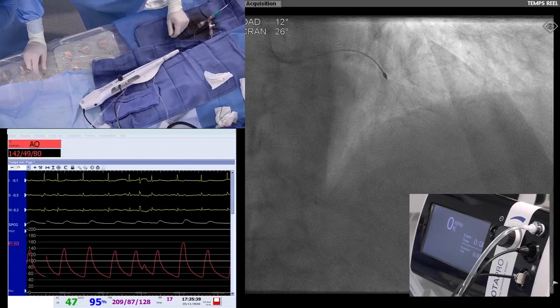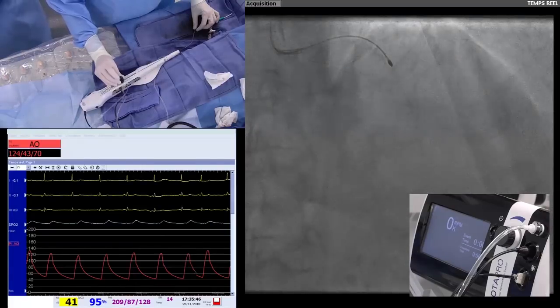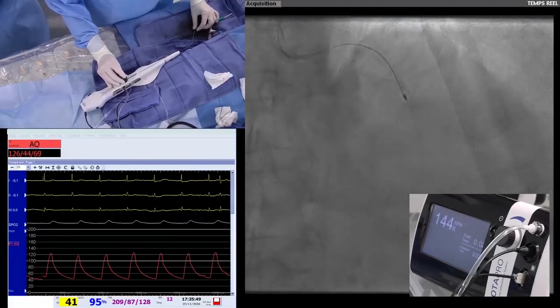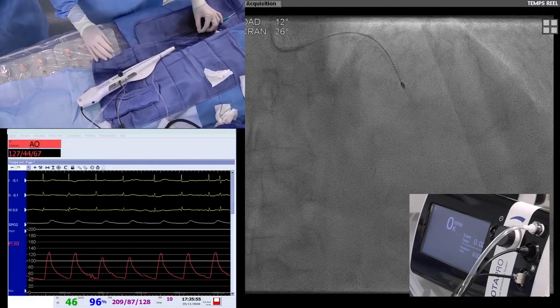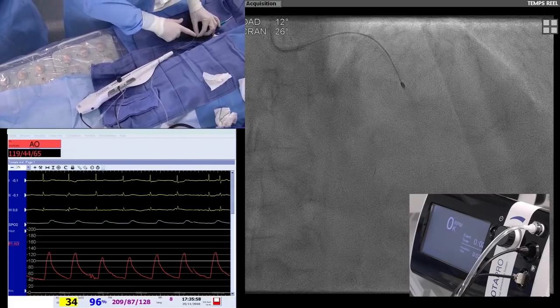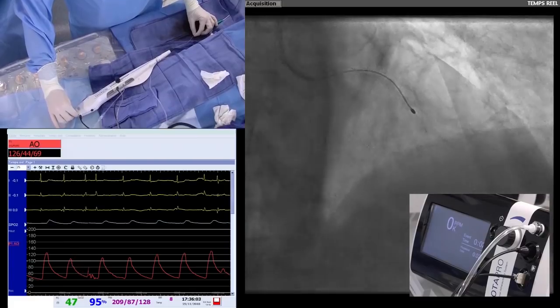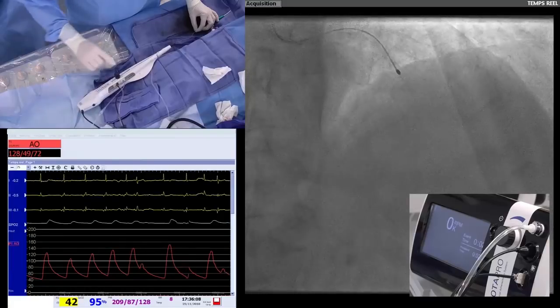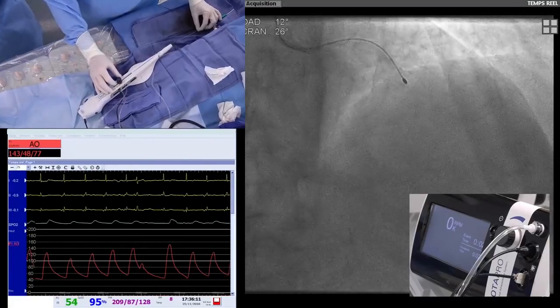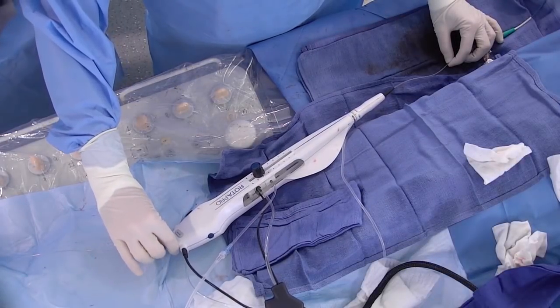It's okay. Maybe I can show you how to advance the burr more distally if you want. Yes, that'll be a nice thing to see. So I start to advance it. I stop. I am in this part. With my left hand, I will block the shaft of the burr, and with my right hand, I will pull the wire, which is quite distal, and you will see the molette in French. I don't know the word in English. Sorry. The knob. The knob will go more distally.